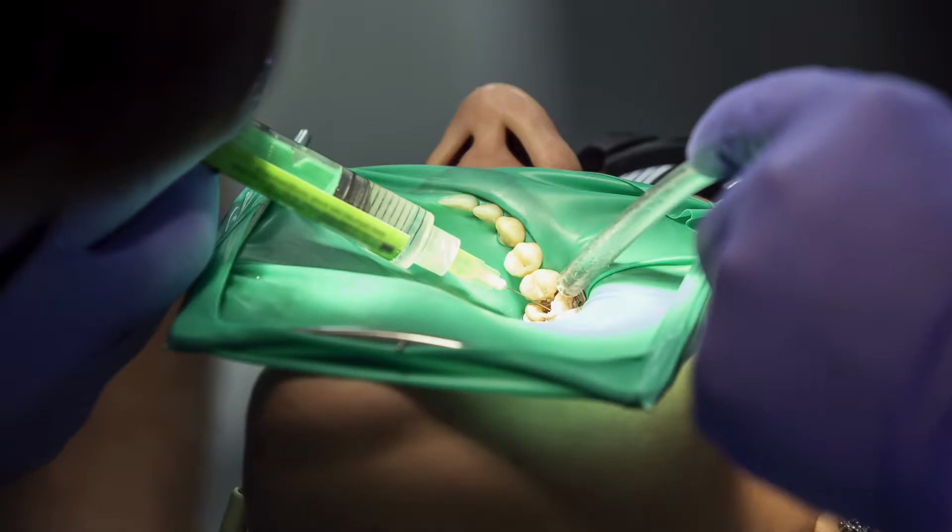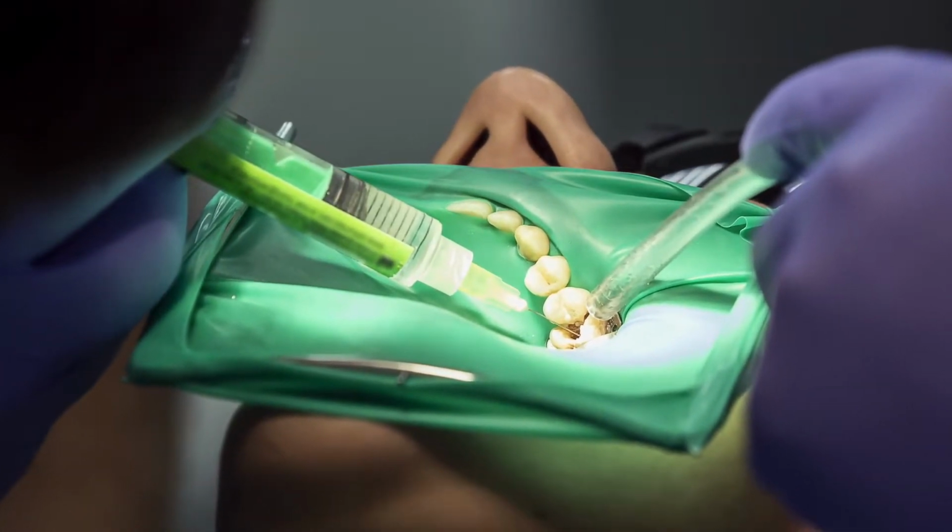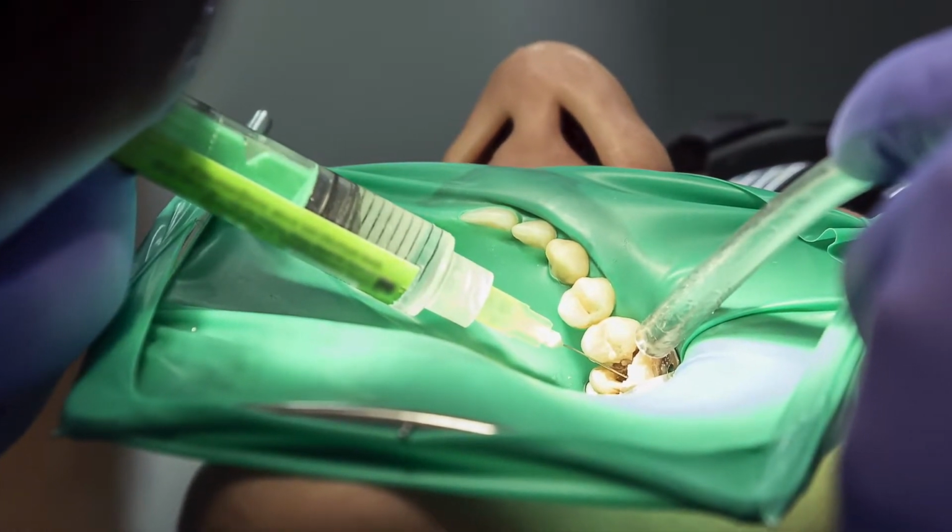Mechanical debridement combined with chemical effects of irrigants, such as sodium hypochlorite, is sometimes referred to as chemomechanical preparation or biomechanical preparation. And the goal of chemomechanical preparation is to mechanically instrument the tooth to remove any type of bacteria or infected dentin inside that tooth. But it's also a goal to prepare that tooth enough so we can actually get the chemical irrigants far enough into that canal and deep enough into that canal to actually further reduce those bacteria counts.